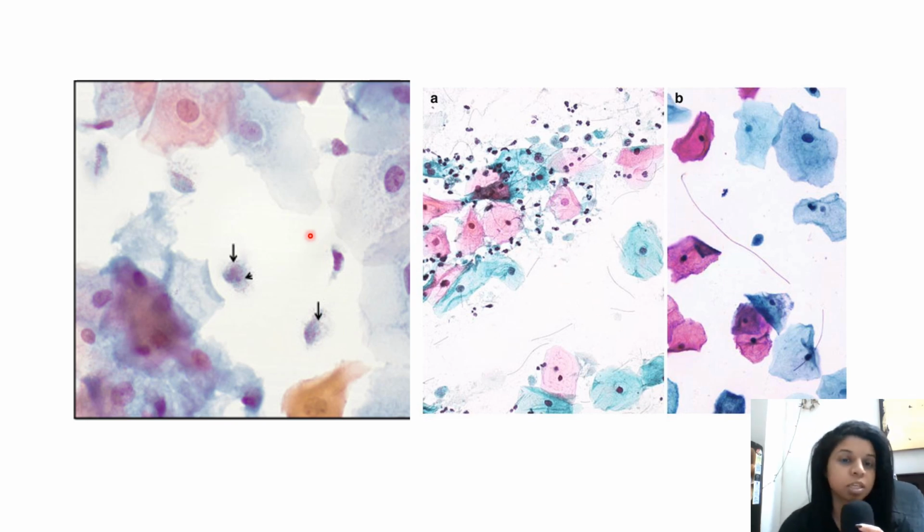I have seen Trichomonas in many pap smears, but I have not seen much Leptothrix associated with it. But if you see thread-like structures or organisms along with Trichomonas, I hope you can understand the Trichomonas seen here. So these are Leptothrix and there is Trichomonas.